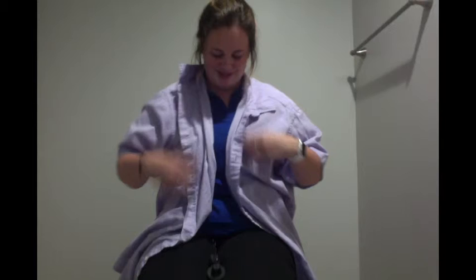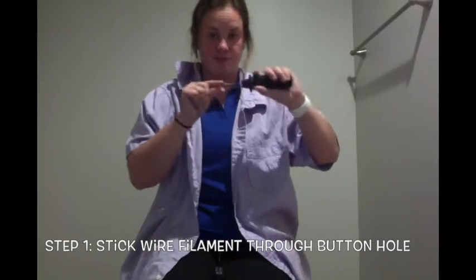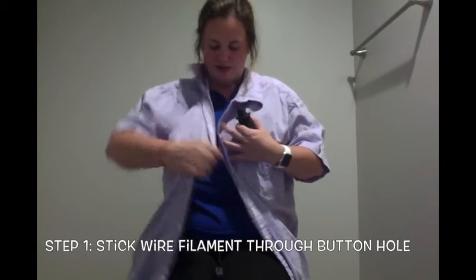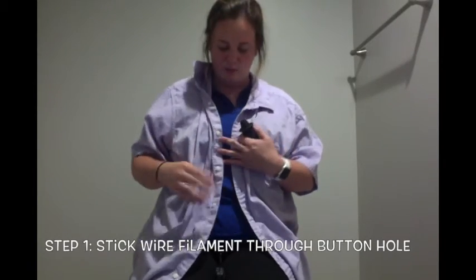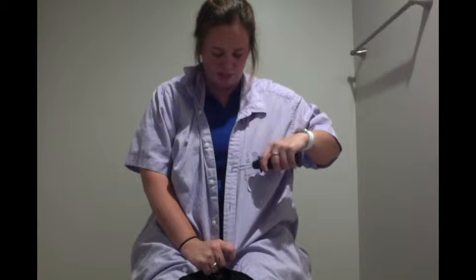Let me get on my button shirt and we will get started. You're going to use your dominant or your unaffected hand and you're going to stick the wire filament through the buttonhole. Sometimes it helps if you use your affected hand to fold down the shirt so that it doesn't slip and it's more stable for you.